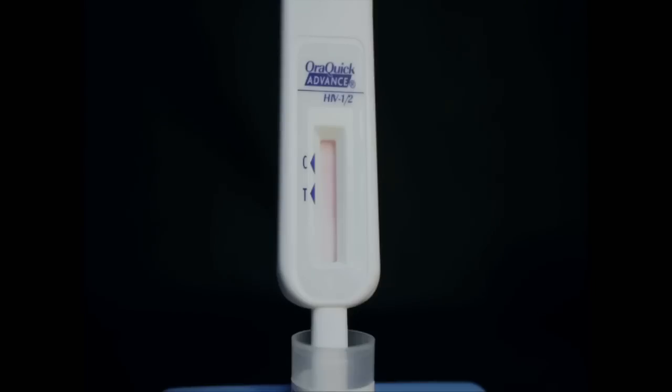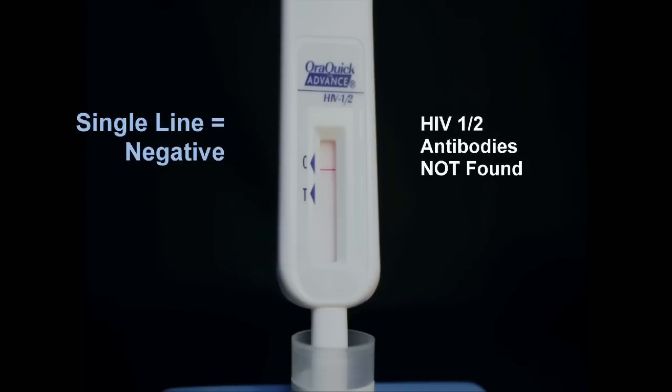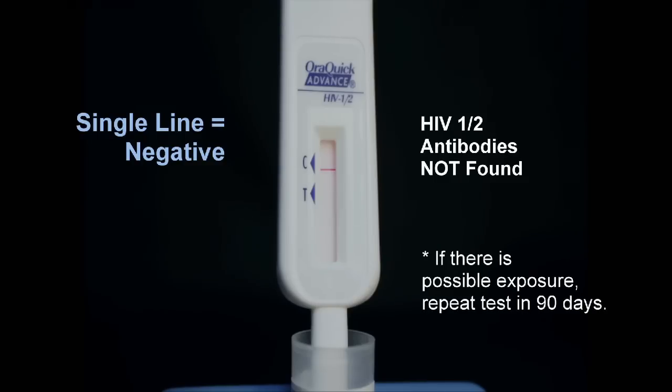It is important that you read the results in a fully lighted area. After 20 minutes, look at the result window of the test device. A reddish purple line next to the triangle labelled C and no line next to the triangle labelled T indicates a negative test. A negative test means that HIV-1 and HIV-2 antibodies were not detected in the test sample.